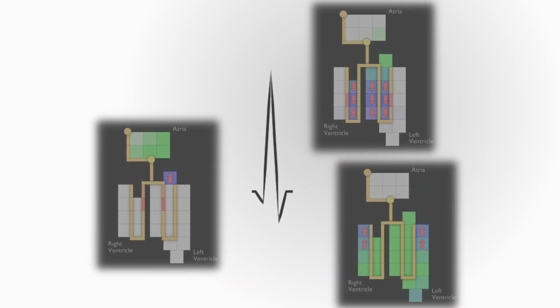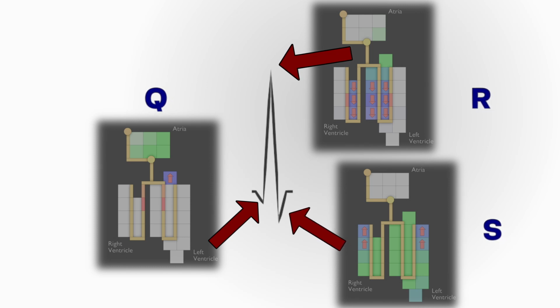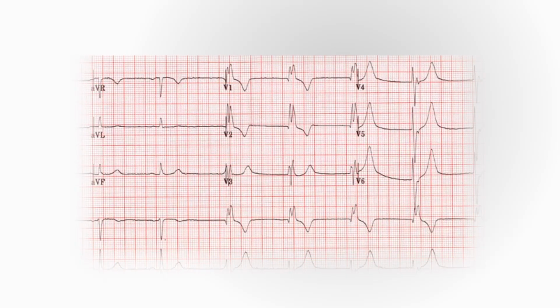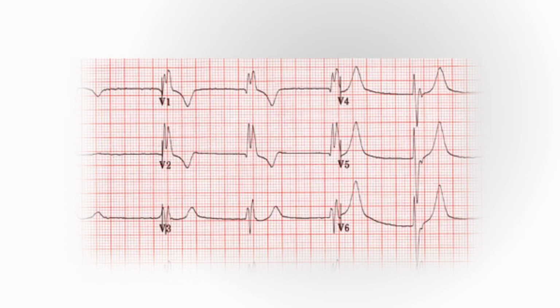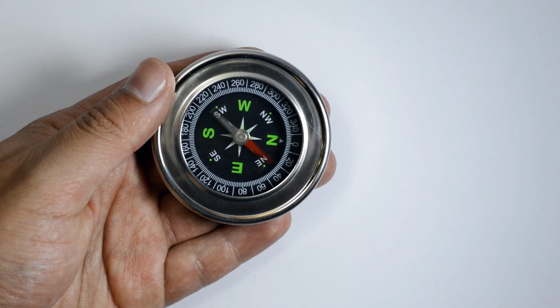To review one final time, what we're actually visualizing with a QRS complex is the movement of energy, and when that energy changes direction, we see that manifest as a new wave within the QRS complex. Unfortunately, it can get more than just Q, R, and S. Some pathologies like scar tissue formation from previous damage or problems with the bundle branches can create extra deflections beyond our normal 3. Depending on where you look, the naming conventions for these varies a little bit.